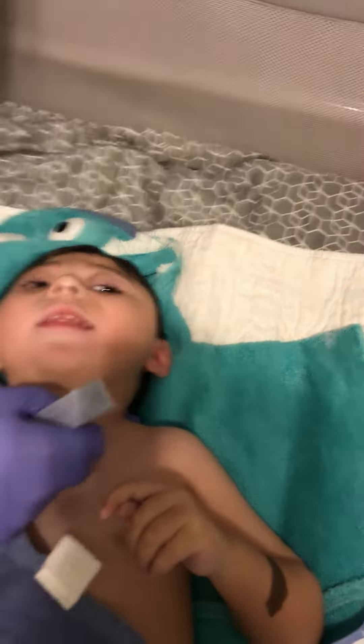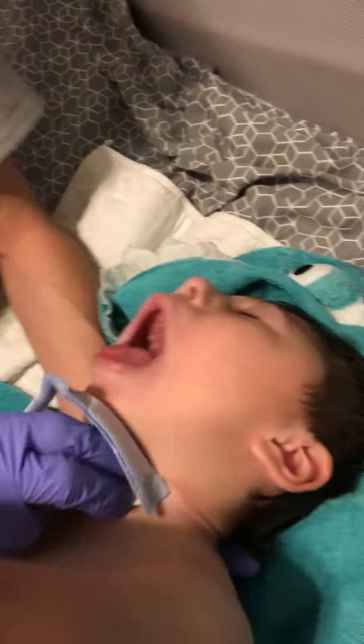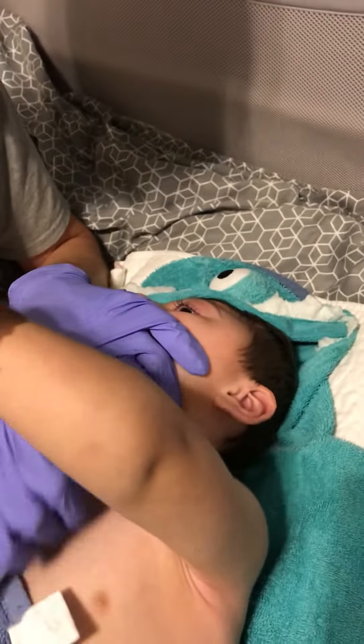We're going to insert the new trach — gently. We're going to quickly pull out the obturator, because we have to remember that if this is in there, the child cannot breathe. We block this airway.